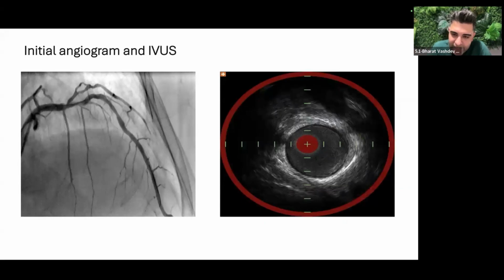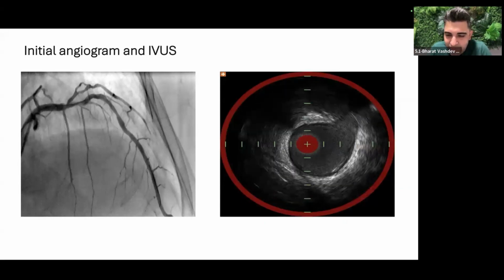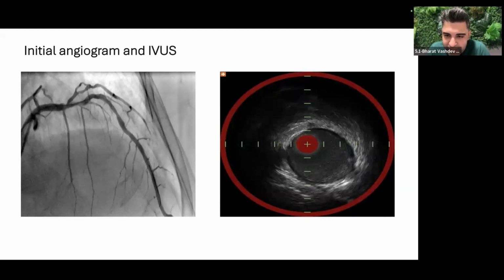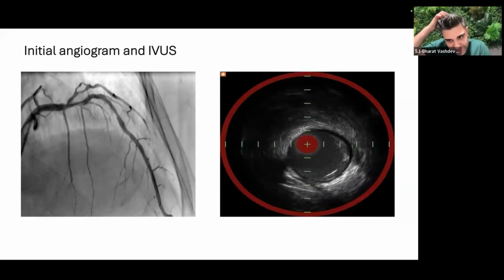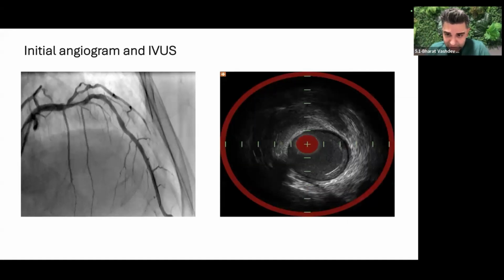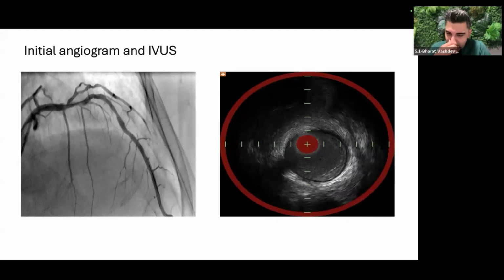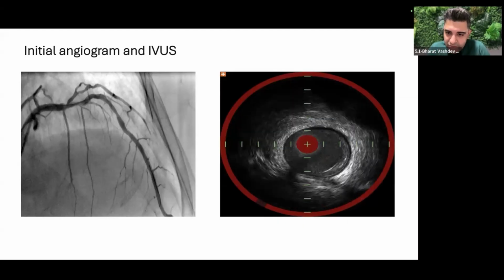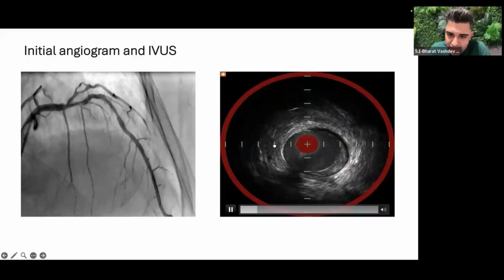I have a new toy in my cath lab, a NERS IVUS, so I've been playing a lot with it to do pre and post DCB and pre and post stenting and pre and post prep. It's quite a fun toy to play with, but really I'll wait for the section just distal to the diagonal. It's a bit of a long run.